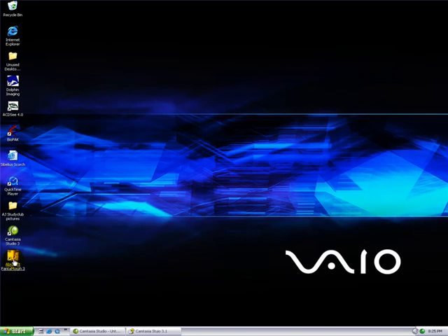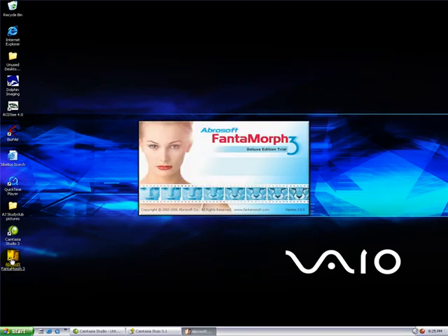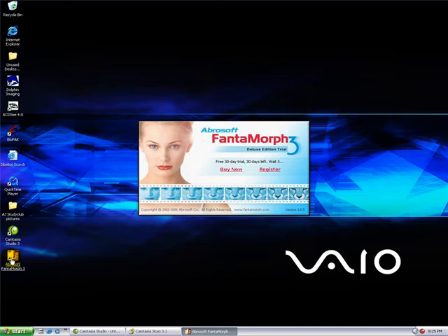Start by clicking on the icon of VentaMorph. If you have a trial version, it will take about 10 seconds before the program starts. You have 30 days for this trial.